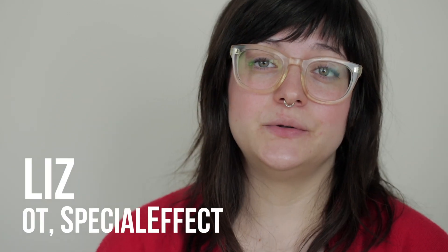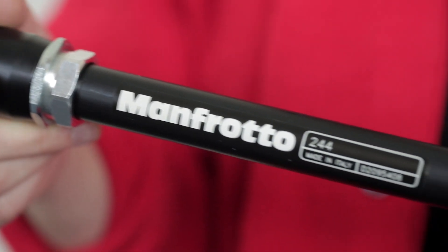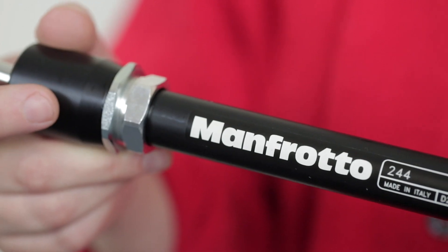We often need to mount equipment to hold it in the correct position using a mounting arm. The option that we most often use is the Manfrotto Variable Friction Arm. In this video we're going to have a quick look at how to set this up safely.